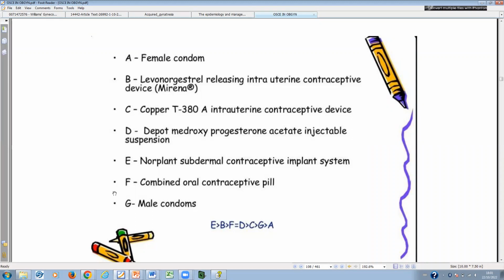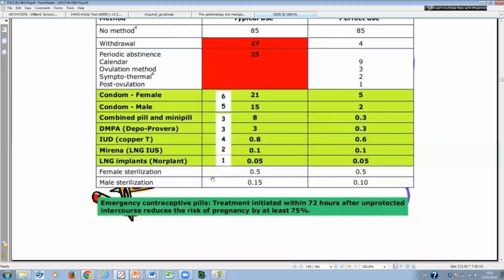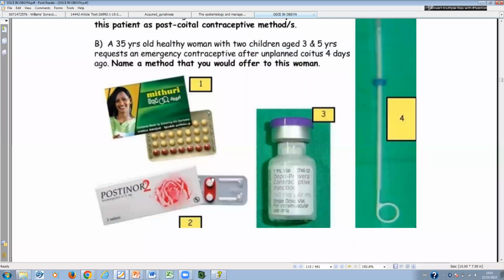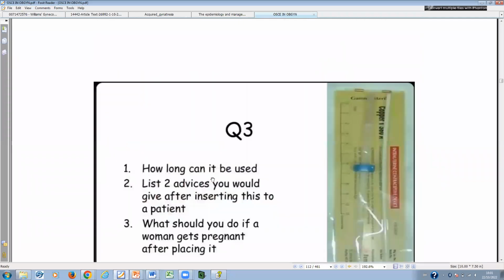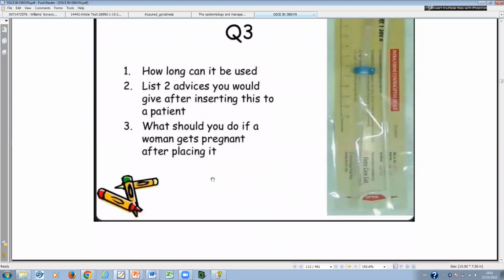So these are some notes, the failure rates in typical use. Then these are the contraceptives that I talked about. So this is the copper T. The question here, they can ask: how long can this be used? List two pieces of advice you give after inserting it. What should you do if the woman gets pregnant after placing it? These are things you have to explain to the woman.